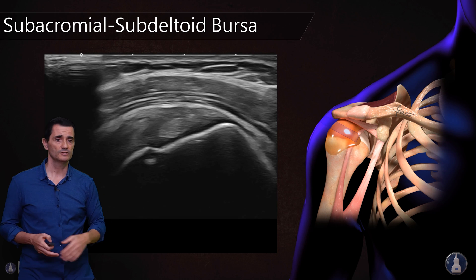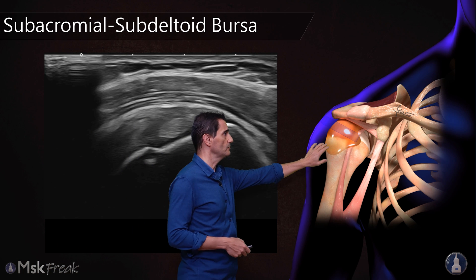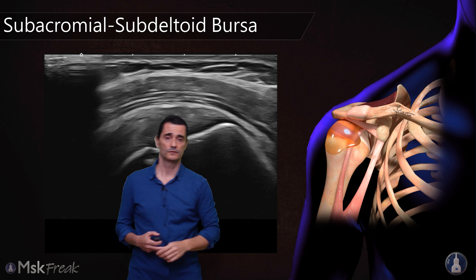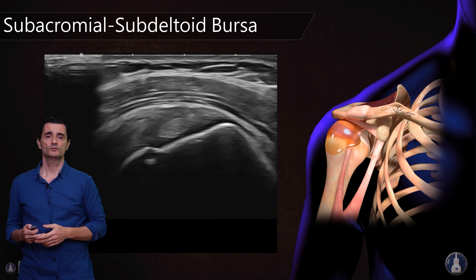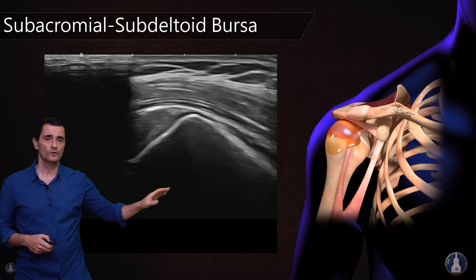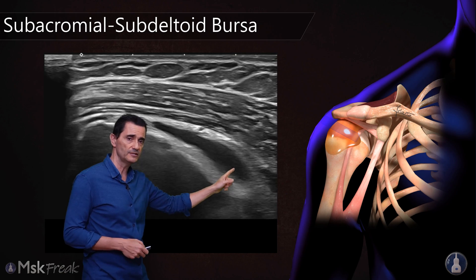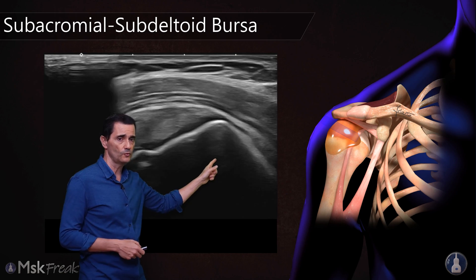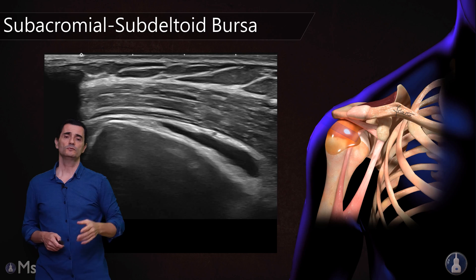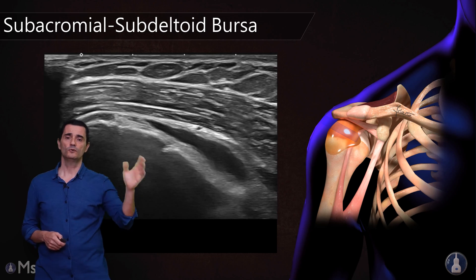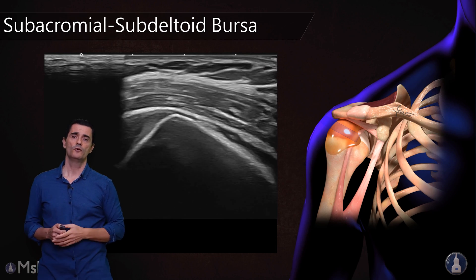Remember that the bursa can reach the lateral aspect of the humerus, the greater tuberosity. We can go over the greater tuberosity and sometimes we will see the pouch with liquid inside. Don't forget to go lateral if you want to be sure there is no bursitis.